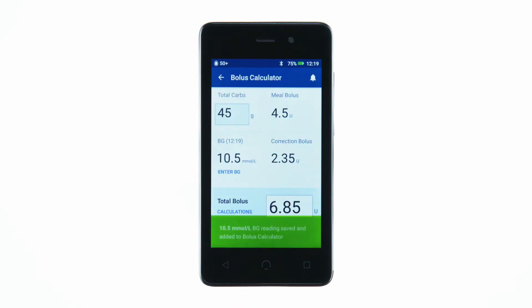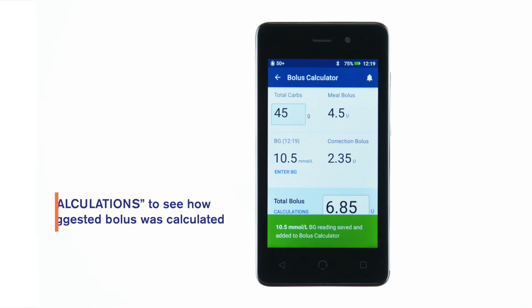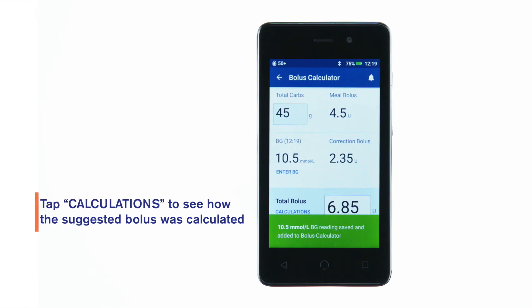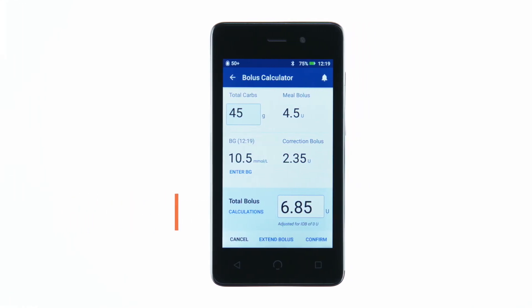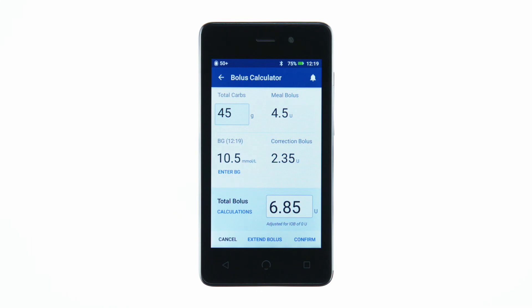You will see your BG value entered. Review suggested meal and correction boluses to the right of each value. Tap Confirm.